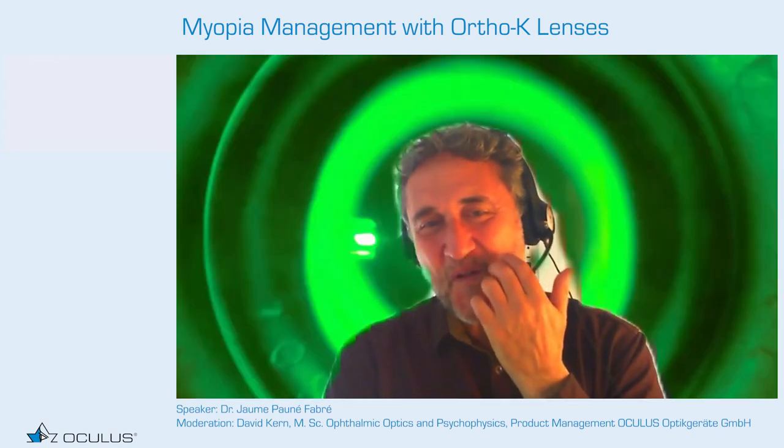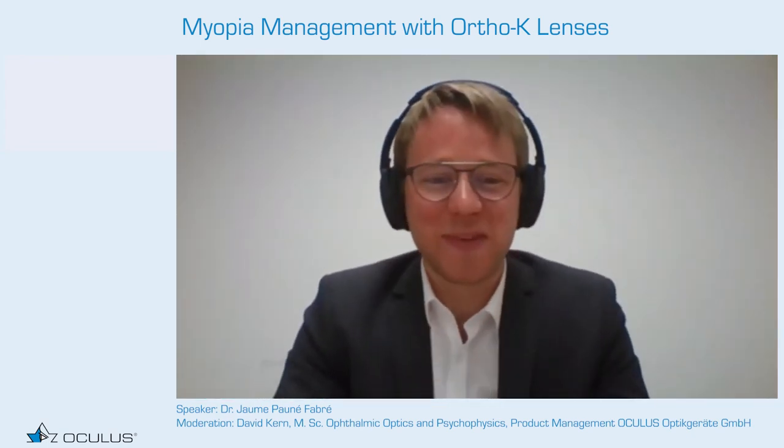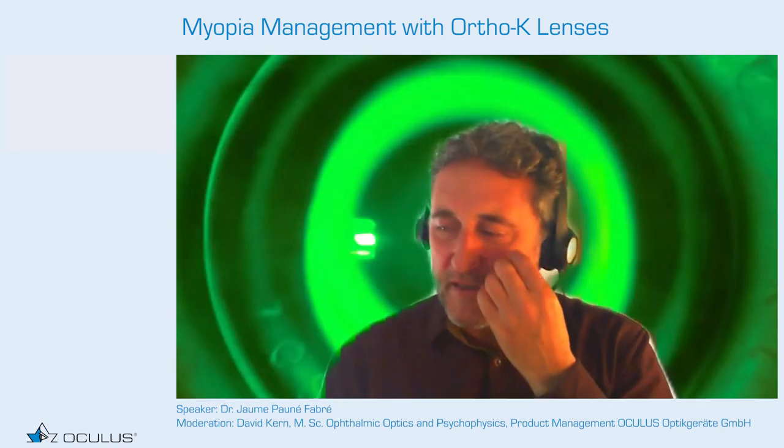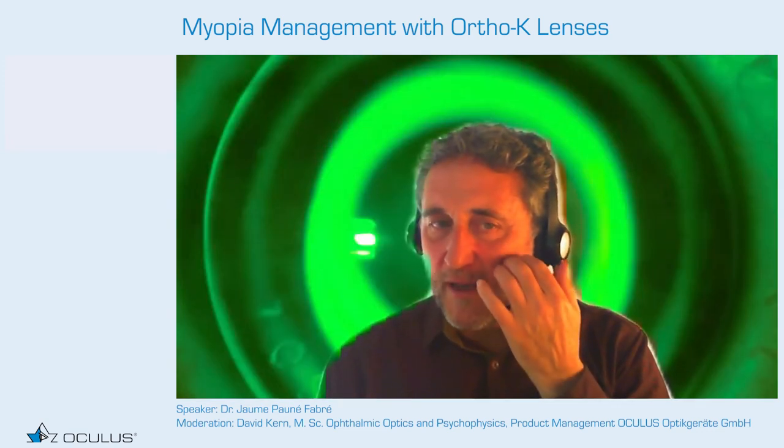So with the Myopia Master, we go back to the Myopia Master device. It's possible to show what the future outcome of the refraction in adulthood will be, or also axial length. The question is, does the Myopia Master also show the treatment? For example, the treatment of orthokeratology lenses, what's the outcome in the future? For example, 60% or something like that. Yeah, it's not doing that in the Myopia Master.